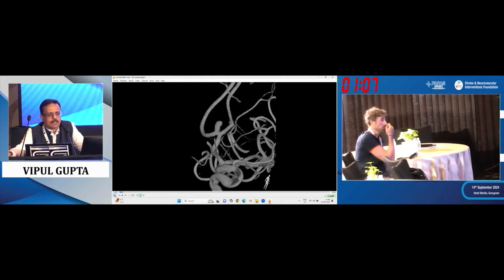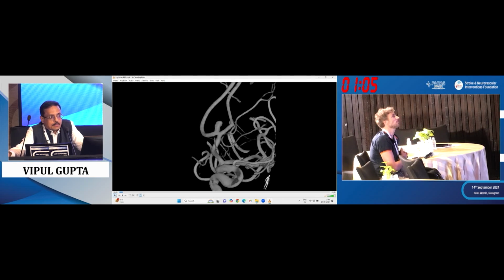Perfect, perfect. Yes, it does look like a great case for Web. The problem in India, I think the problem with us, is that it's more costly than coiling, and because we end up doing coiling, none of us have done that many Webs. I think not even 100 Webs in this country, and that becomes a challenge.